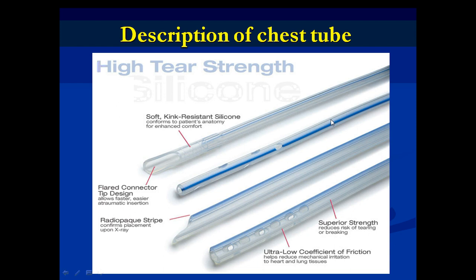So we can see the location of the chest tube, its position, is it in the intended position or not, if it's kinked, if it's present in an abnormal location after its insertion, if it's inserted blindly in the primary pleural disease as we mentioned before, pneumothorax, hemothorax or whatever. So this radiopaque line gives us an idea about the position of the chest tube inside.